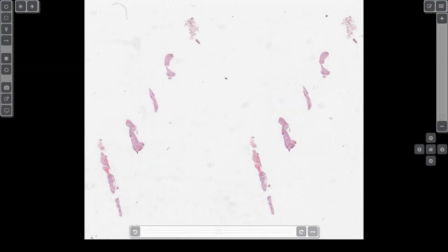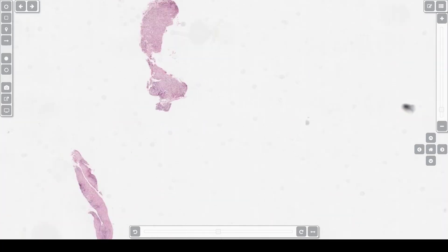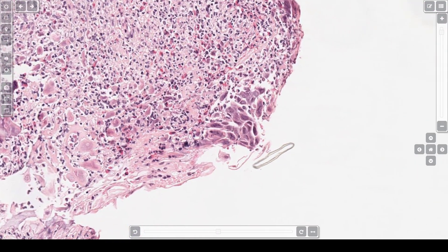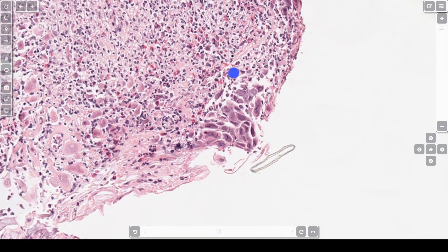This is case 6: herpes esophagitis. Taking a closer look at this piece, at this power you can see there is necrosis — I know there is necrosis because the tissue has a faded look. In addition, there are a lot of inflammatory cells. This area right here is a little cluster of herpes virus inclusions. This is herpes esophagitis.